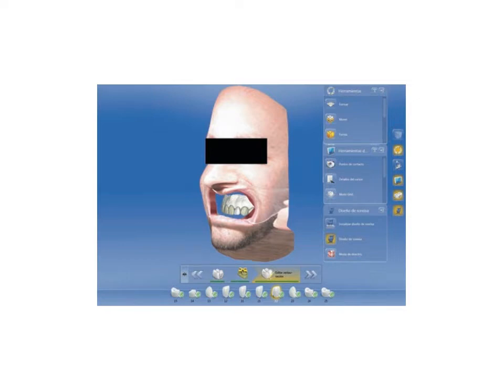There are several types of software on the market, from the simplest ones like Keynote, PowerPoint, and Photoshop, which allow a two-dimensional analysis, to other more specific ones, such as RealView from 3Shape, Nemotech, Smile Design from Cerec, and so on, that directly facilitate the entry of the data and allow a simpler workflow.